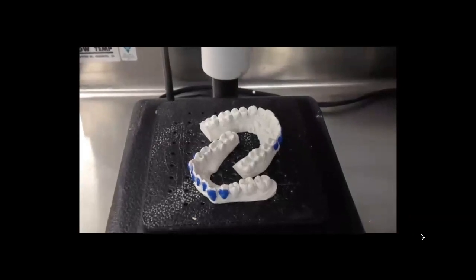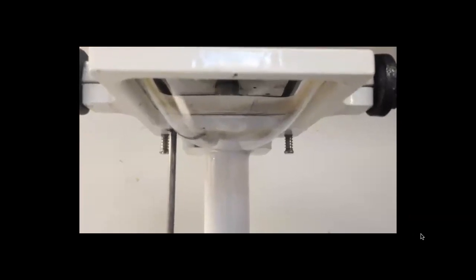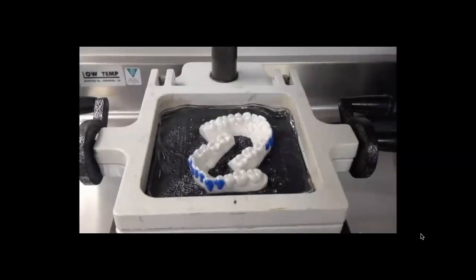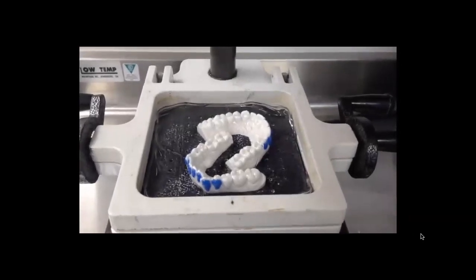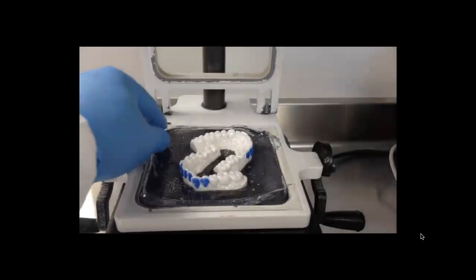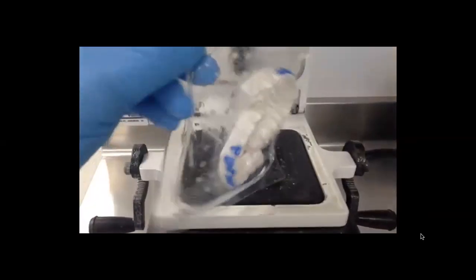We want them very, very thin. You can see how we've been able to trim the cast, put one right next to the other, make that soft tray very soft. You want it to look like a balloon, and then you just bring that tray down, and you can see how you can remove them easily. They're still soft, so you got to be careful, because they're still warm.